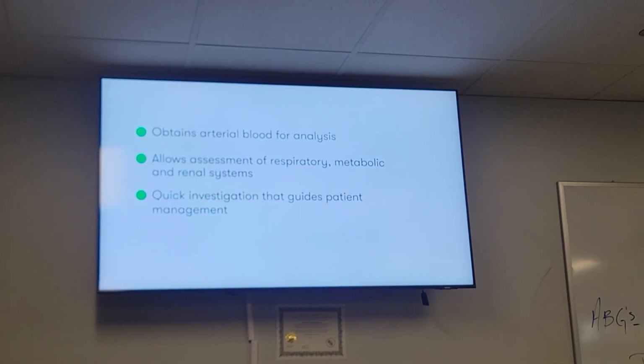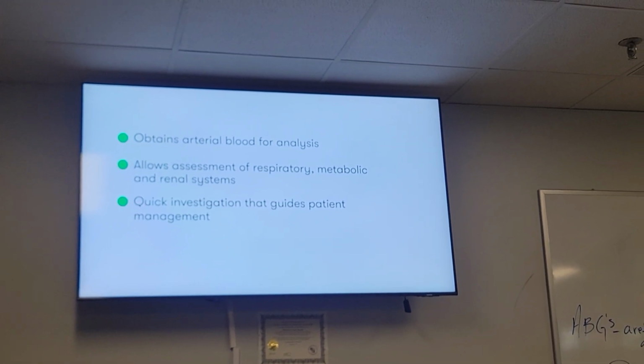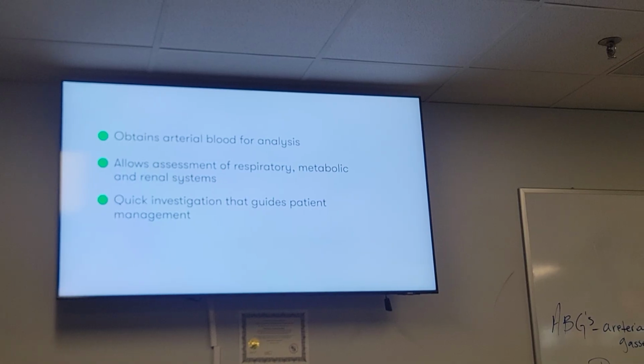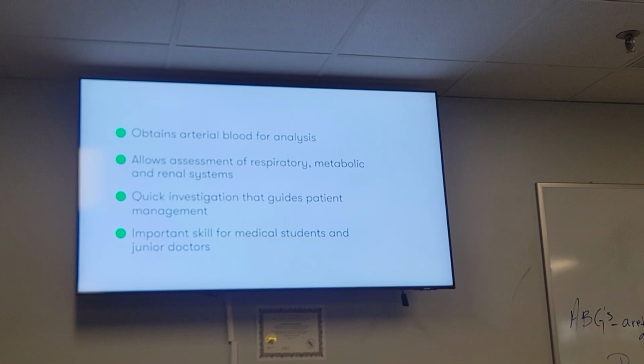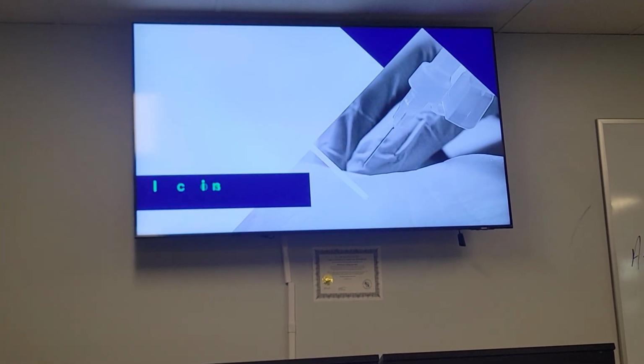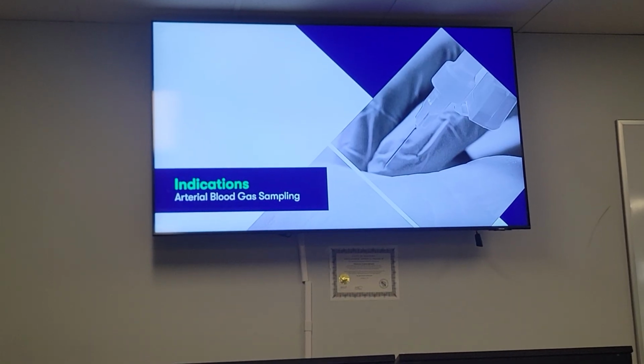Bedside investigation that can accurately guide the management of critically ill patients. Therefore, it's an important skill to be able to perform well and with confidence. Now I'm videoing.